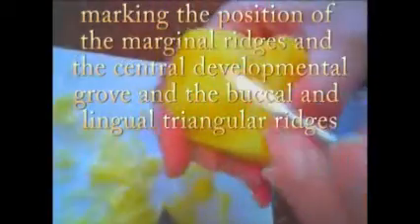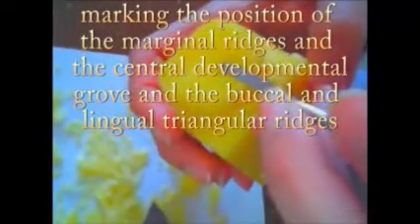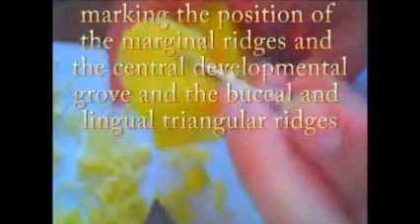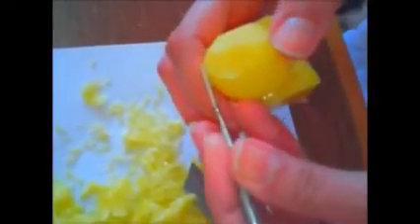Now to the occlusal, we draw the area of the marginal ridge. The mesial marginal ridge is a little bit more occlusal than the distal marginal ridge, and it is about 1/3 the length of the crown. And now we should specify the area of the central fossa. It should be in the middle between the two cusp slopes and not in the middle of the crown, between the two cusps.